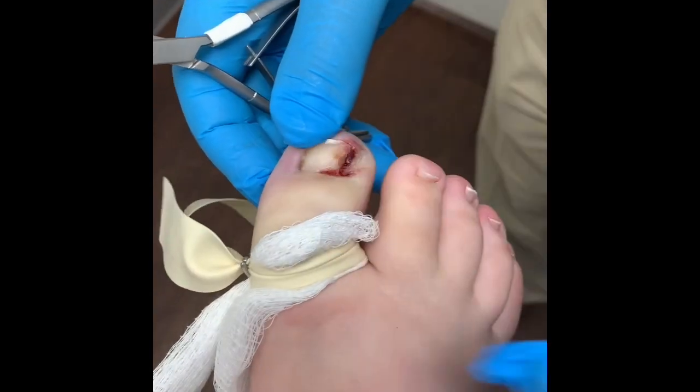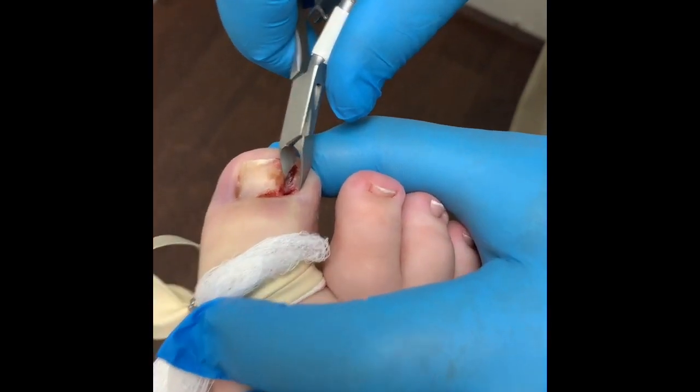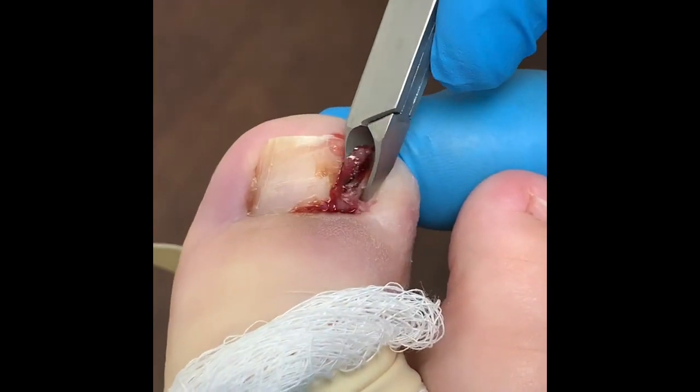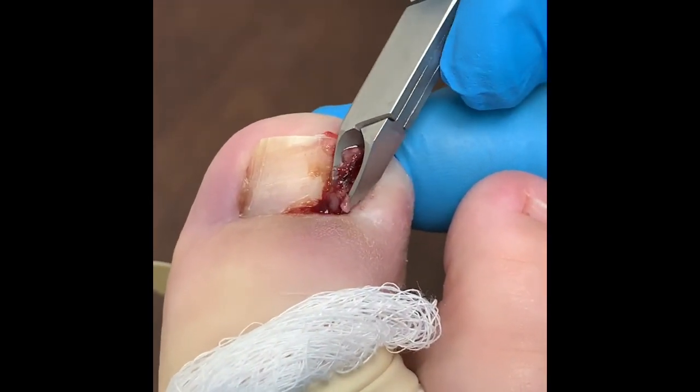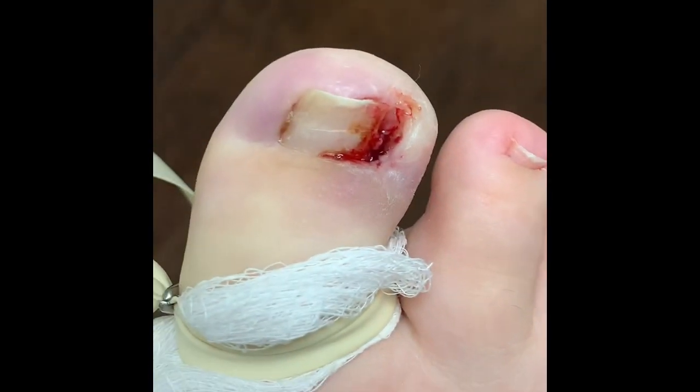The patient has a little pyogenic granuloma. The question is just to excise the granuloma.